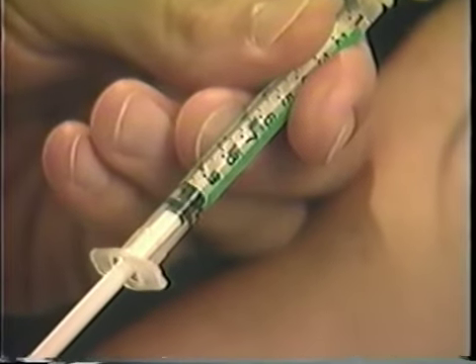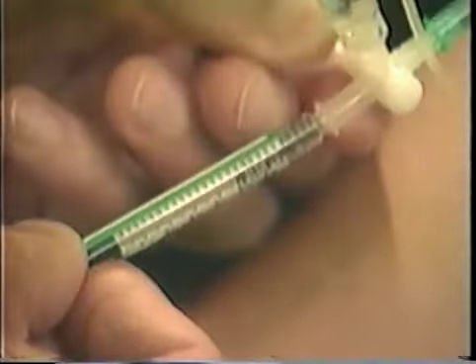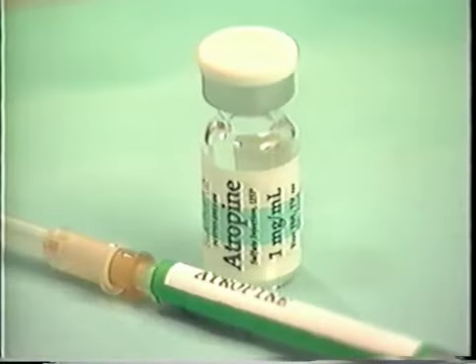First, inject a 0.2 cc test dose of tensilon intravenously. If no adverse reaction occurs, inject a 0.8 cc dose of tensilon and observe the patient's lids and eye movements. Have atropine available as an antidote in case an adverse reaction occurs. Note any improvement in eyelid position or strabismus. If prisms are not available, a Maddox rod may be helpful in documenting improvement.